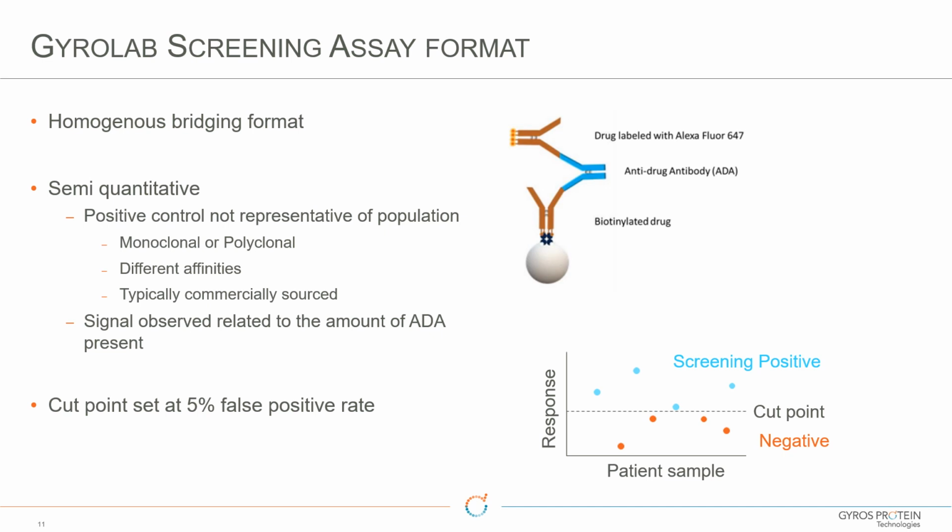Yeah, I've been involved in many validation programs where we've validated the assay using both monoclonal and polyclonal. We use the polyclonal for sensitivity and drug tolerance, and then we use the monoclonal for long-term system suitability, effectively to show the assay performance. That's the thing I'd want to be sure about, that year in and year out, my assay is still the same.